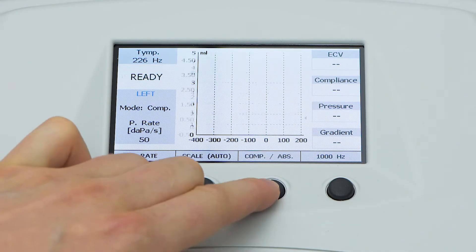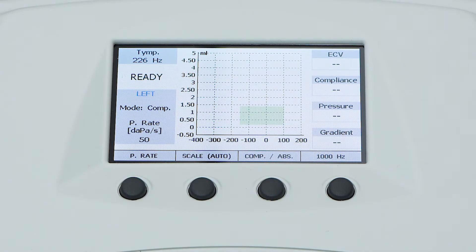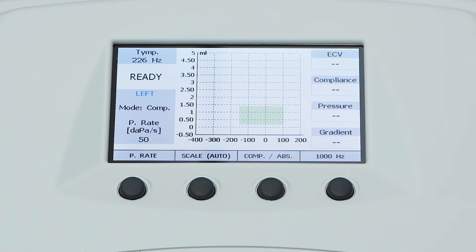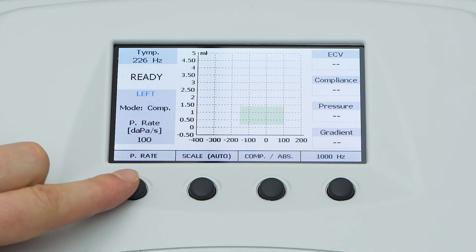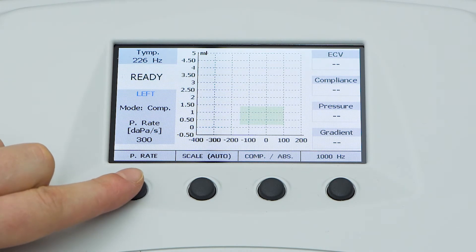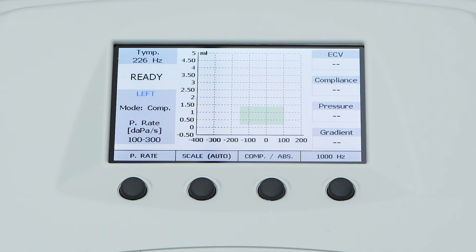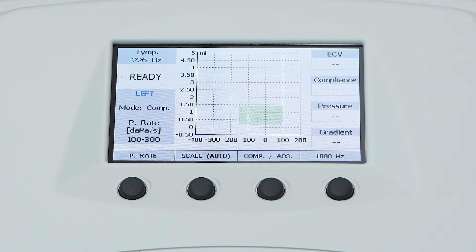Select compensated if you wish to compare tympanograms among different patients. Here there is also the rate of the pressure sweep during the test, where it is possible to select different fixed values or choose the automatic speed adjustment between 100 to 300 decapascals per second. The central area of the screen is occupied by the tympanogram related to the ear currently selected.